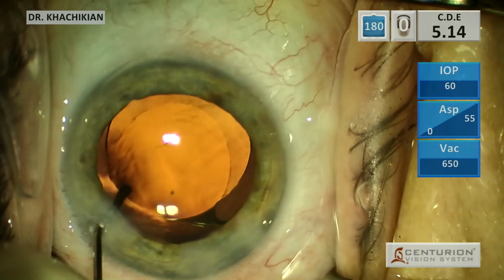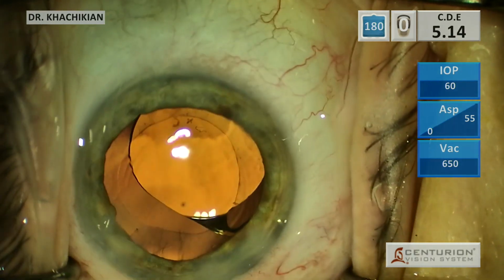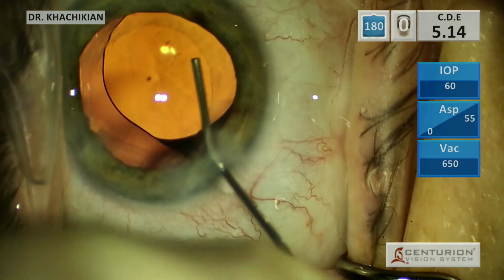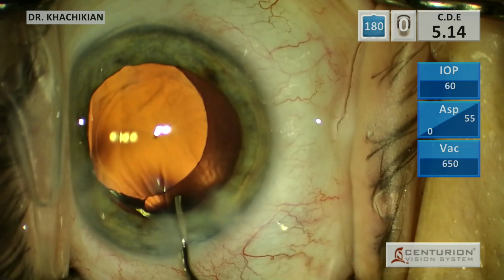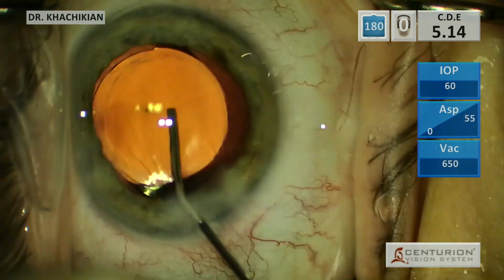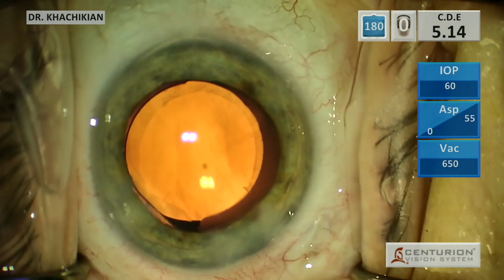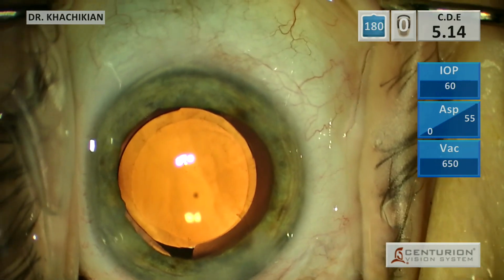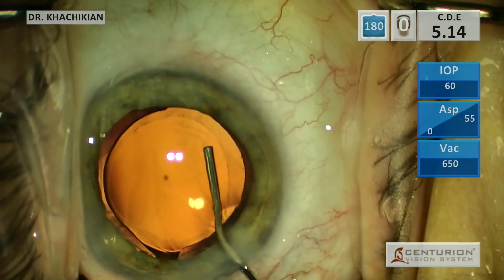I don't really feel like the capsule was engaged in the IA. Oh, there we go, trying to get out that little piece of material behind the lens. I don't really feel like the capsule was engaged in the IA, but just pulling on the cortex got that posterior capsular sheet very loose, likely because the zonules were loose to begin with in that area.